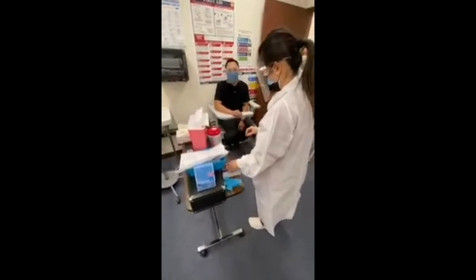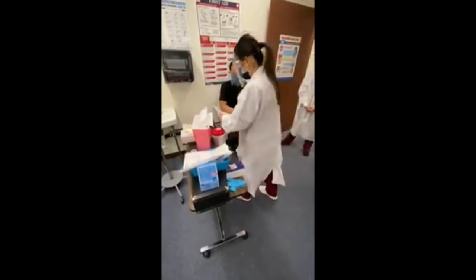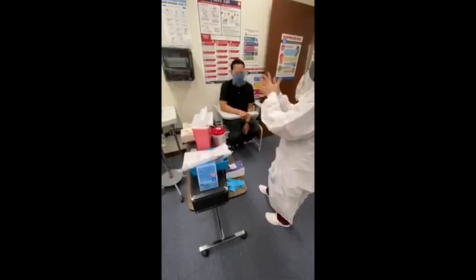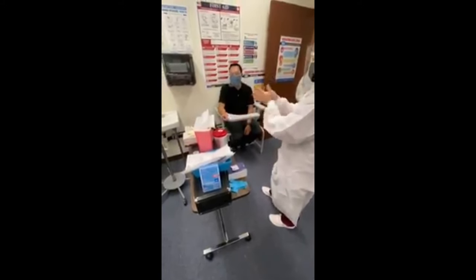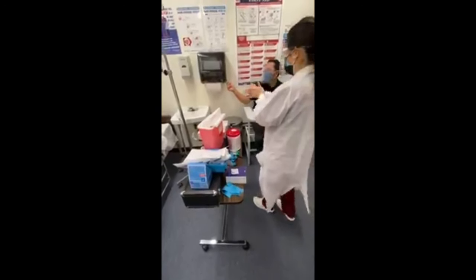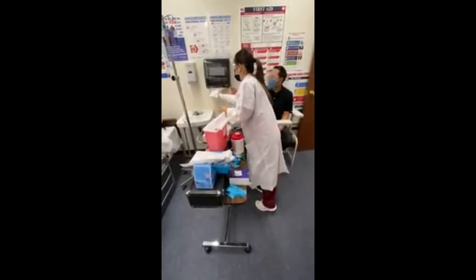Okay, but before you clean the site, what do you have to put on? Let me put on the gloves. Gloves, yes. Perfect. Oh, and if you use the hand sanitizer, you can just dry your hands too because it's going to be hard with the material.